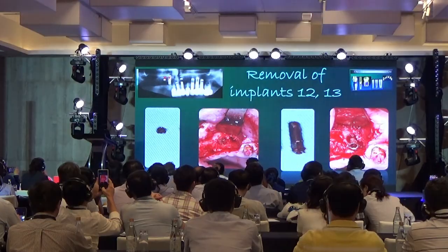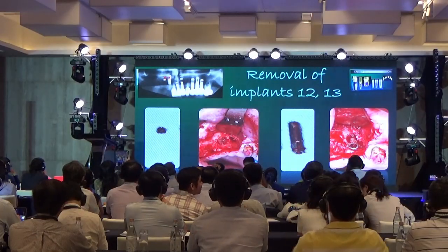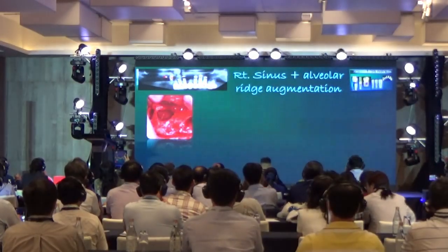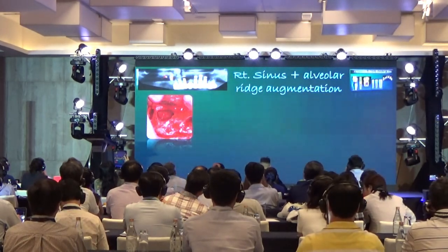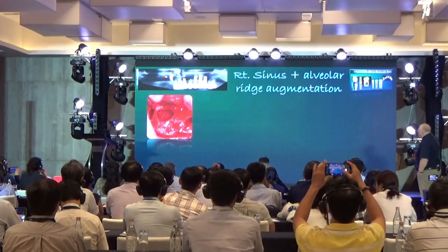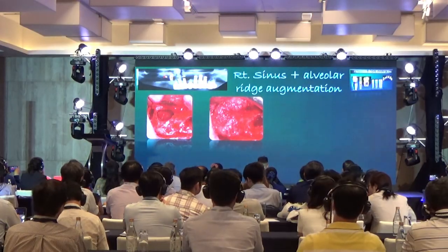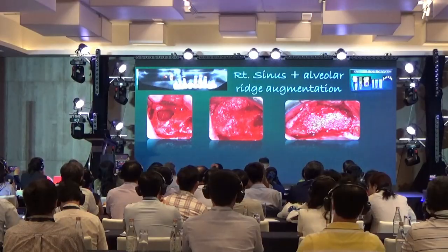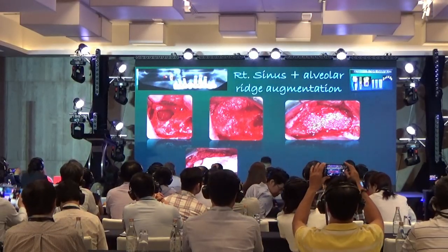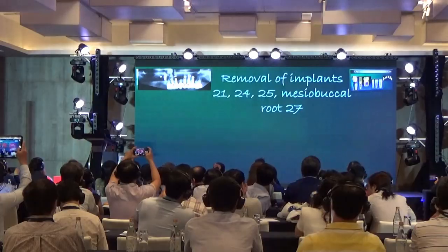So we remove both implants. You can see here the defects that we have. We continue in the same meeting to do sinus augmentation, open the sinus, and fill the sinus, and also did ridge augmentation, covered everything with membrane, and did primary closure.